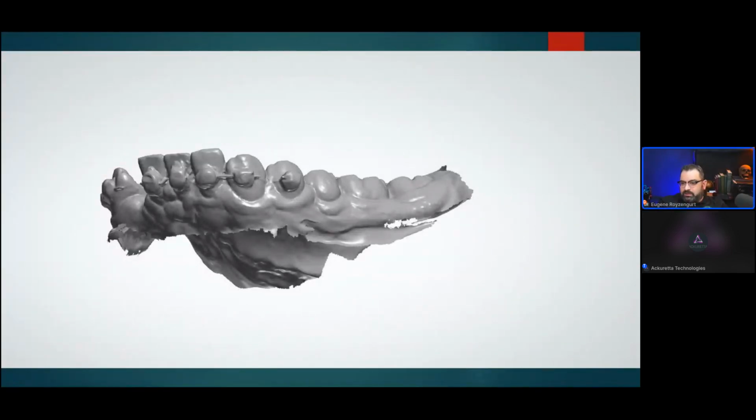Question for me: can you describe the difference of most popular temp denture teeth resins and the denture-based material they've used? Why you prefer one resin over the other? So when it comes to denture teeth resins, the reason why I like this new one that I've been using, it's a sculpture, is because it's highly filled ceramic, so the wear resistance is quite a bit.